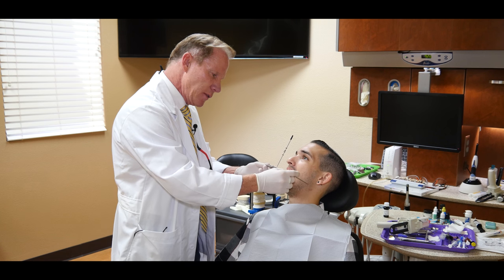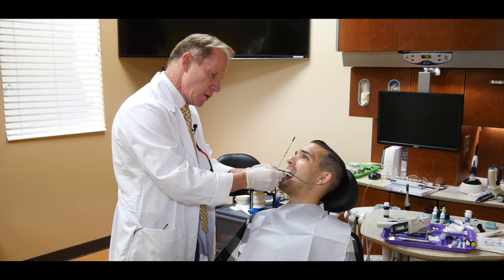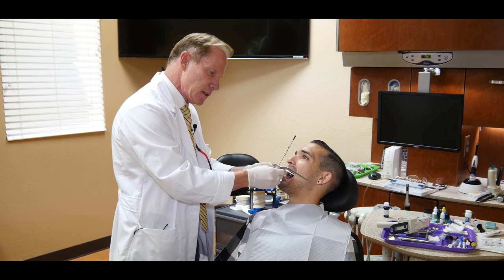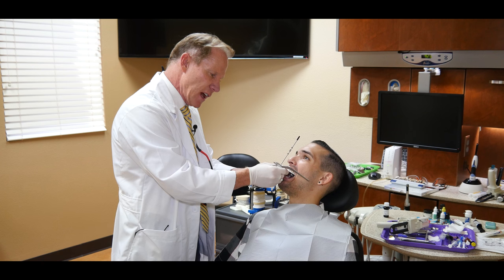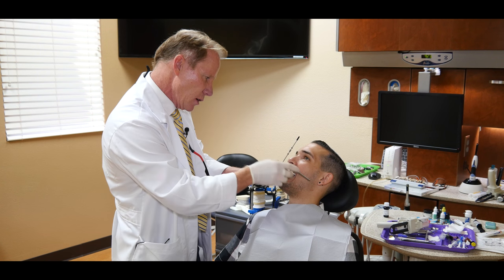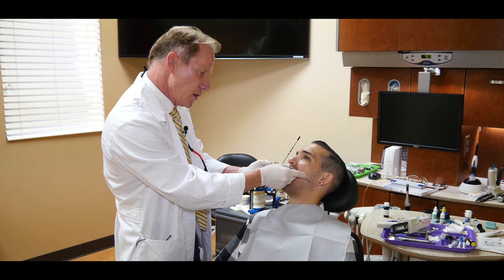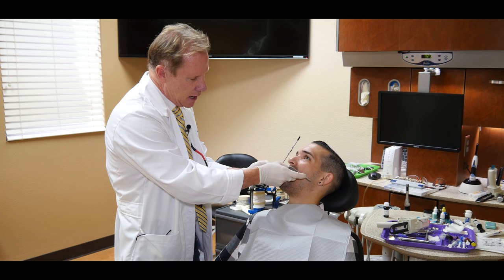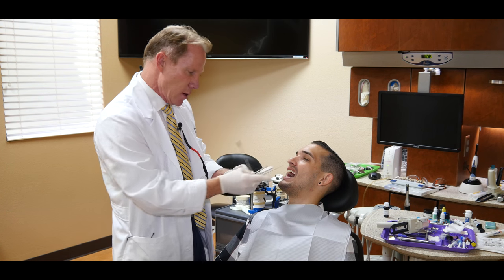So what we do is we leave the posterior away from the posterior teeth, away from the arch. We go ahead and put this front plate against the centrals, both incisally and facially. Make sure the midline is on. Look at the horizontal bar, and then also look at the bow to make sure that it is parallel to his occlusal plane. So let's try that one more time.